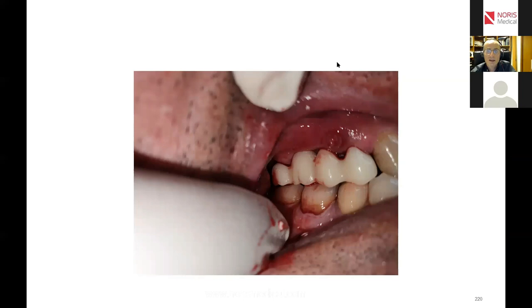Okay, Dr. Reza Amjadi asks me, when we grind the abutment, what is the best way for impression? Actually, I answered alginate for temporaries and putty wash for the fixed. Dr. Mohamed Alubayat asks me, why do you use a temporary cement?